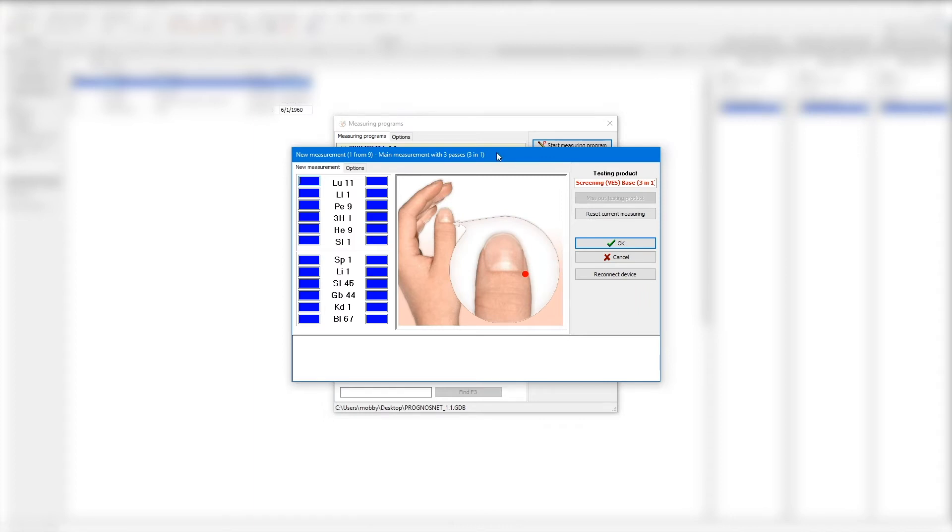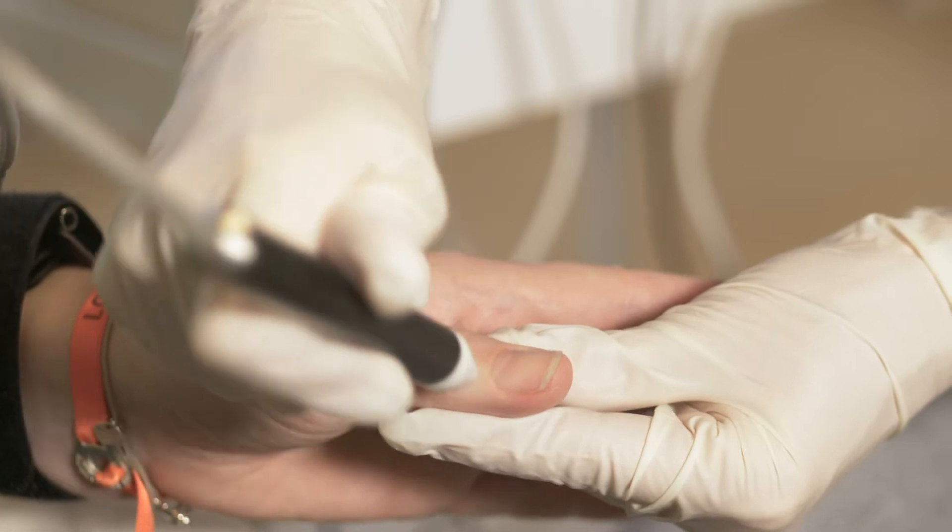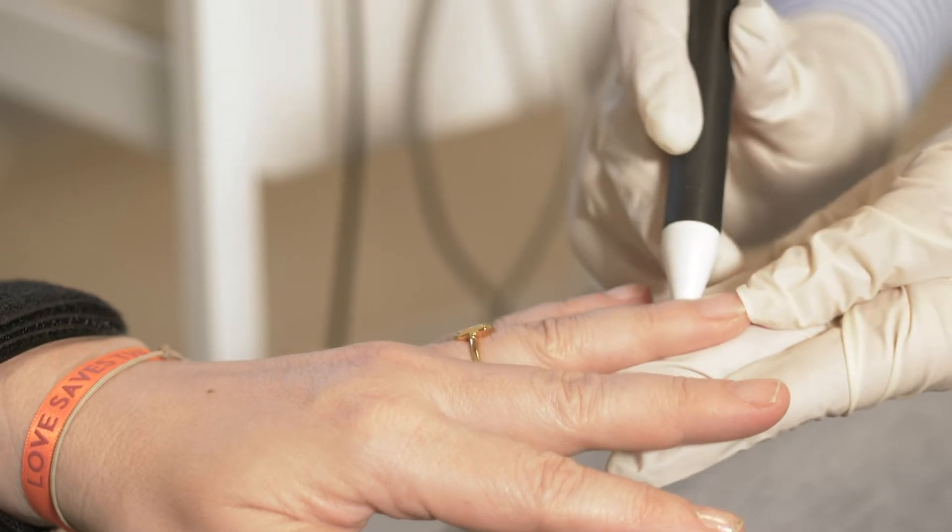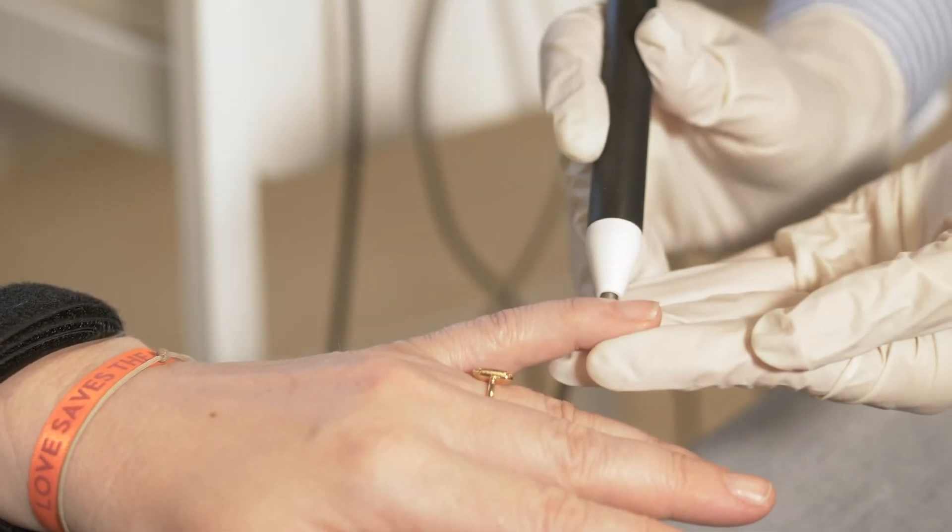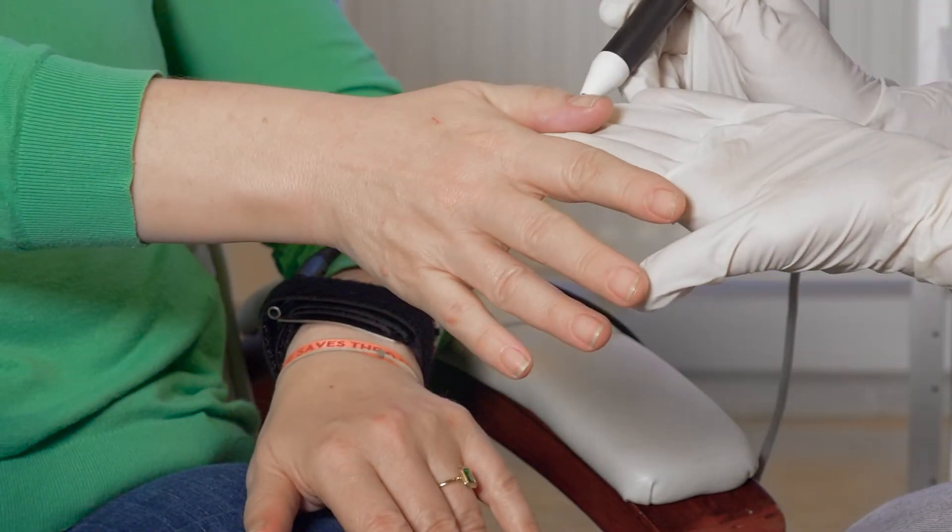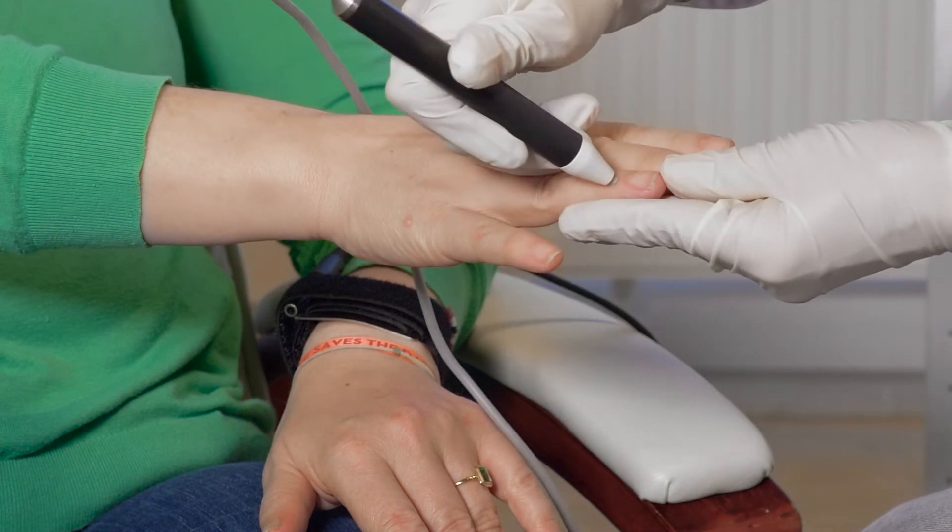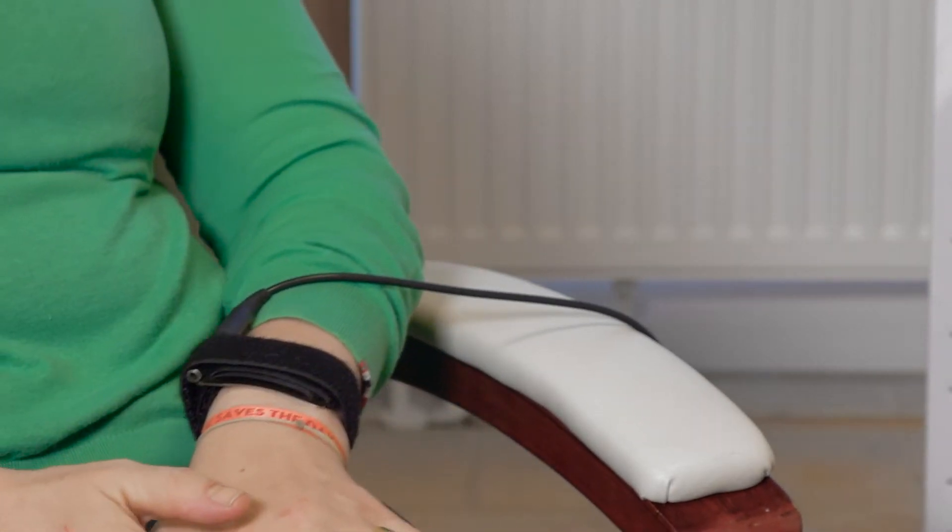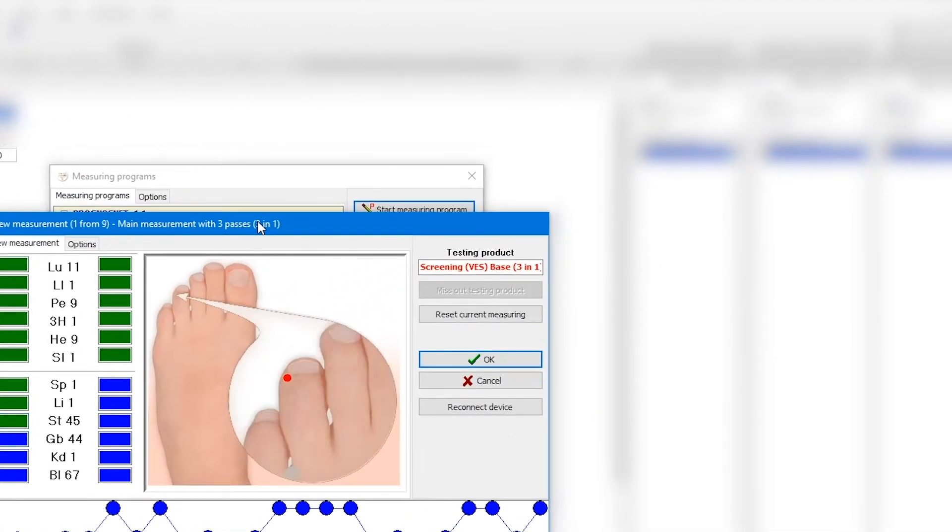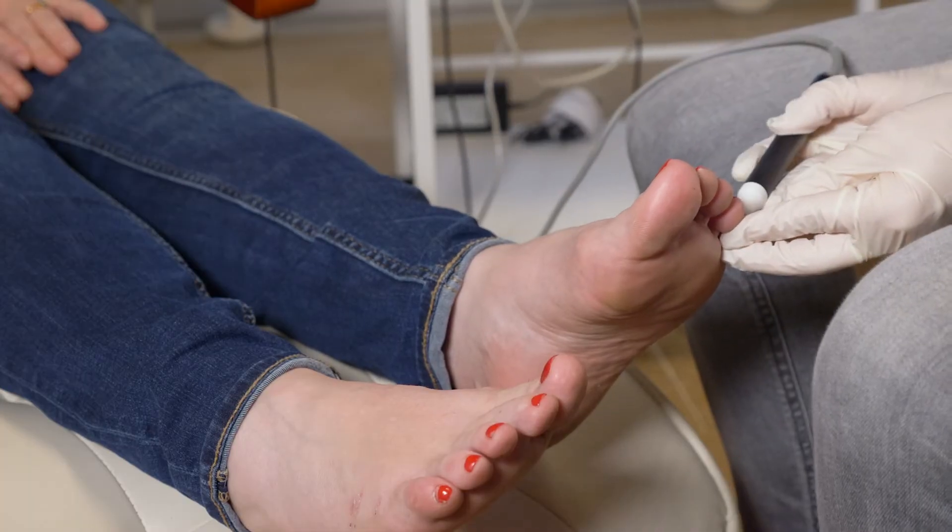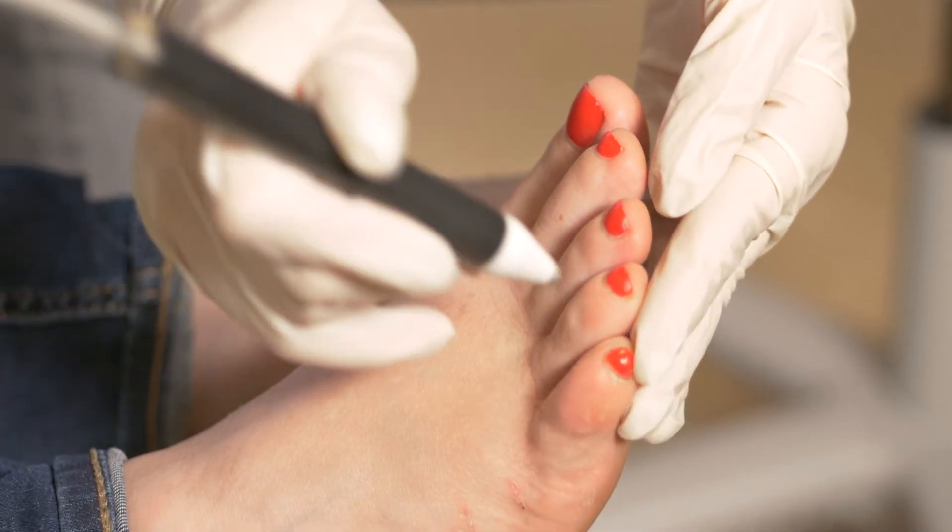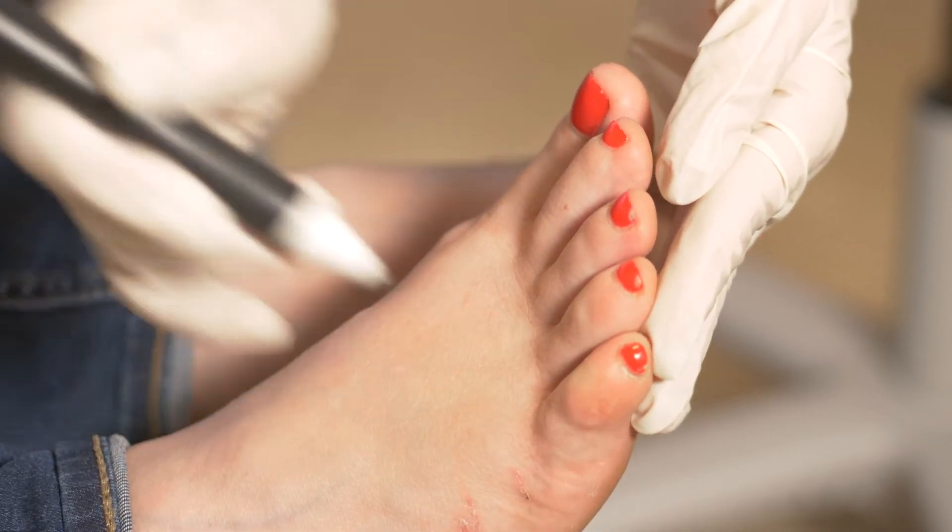Starting with the left thumb acupuncture point lung 11. Then the other acupuncture points on fingers and toes follow. You can prove if you are measuring the right finger or toe at any time during the measurements. Therefore, just have a look on the screen and see the finger or toe symbols with a red dot in the right position. To transfer the signals in the Meridian system, headphones are needed. The measurement procedure starts from the beginning.